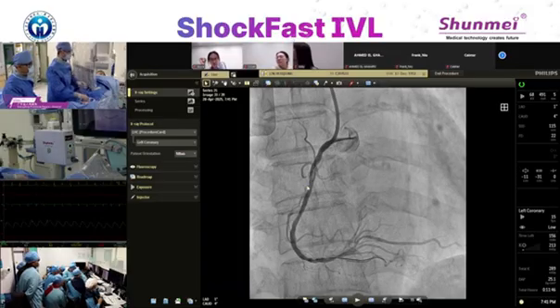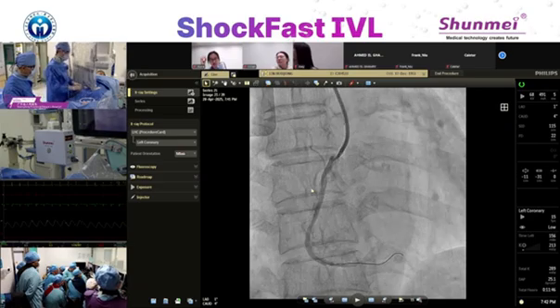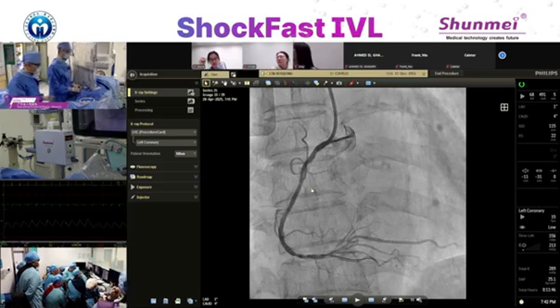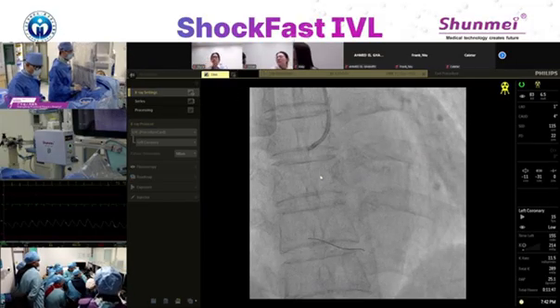Now, in terms of the very distal segment, if I can go, I don't think it's easy to go.